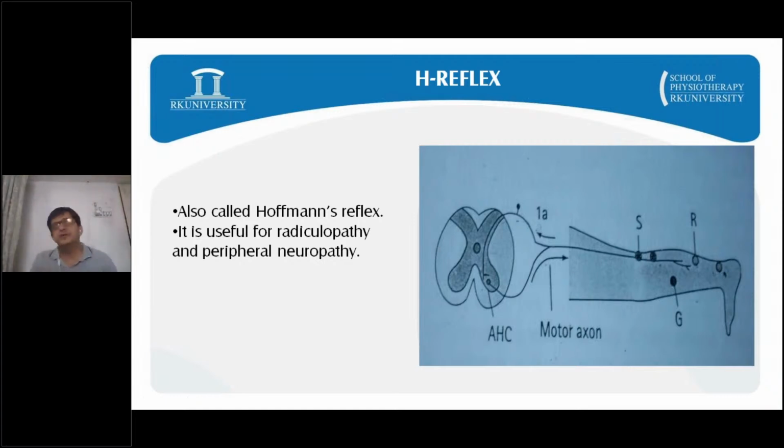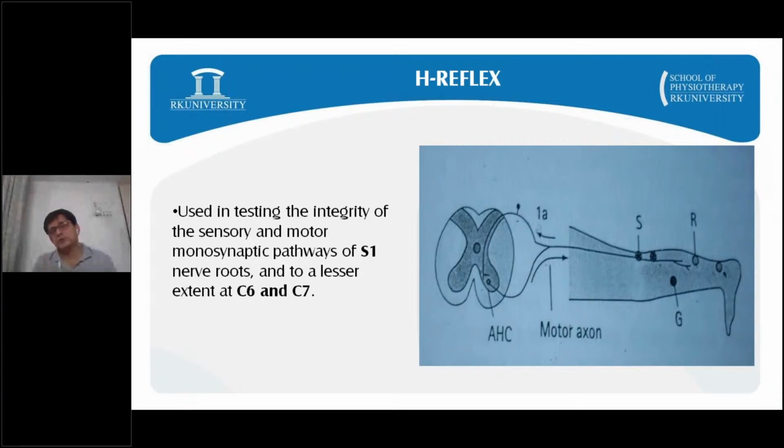Now, this will be useful for limited use only. It may be useful for C5, C6, C7 radiculopathy and S1 radiculopathy. Clear? And actually it is a limitation, but clinically also we are getting patients from this level only, like C5, C6 and C6, 7 radiculopathy, and in lower limb mostly it is S1 radiculopathy. So somehow we are not having more limitation. Otherwise, H reflex cannot be useful for all the nerve roots. Clear? But fortunately, H reflex utility is matching with our clinical requirement.